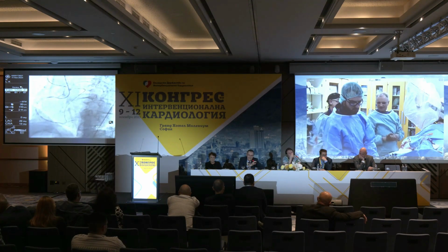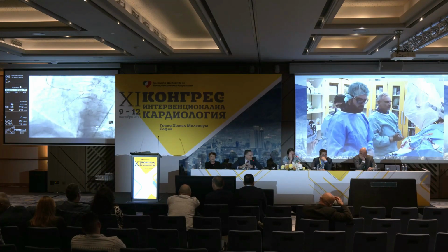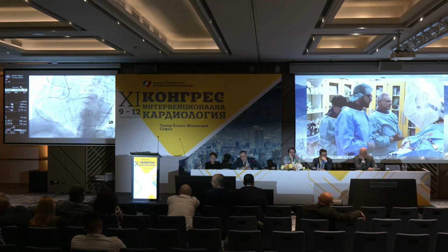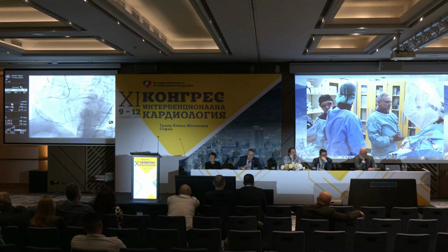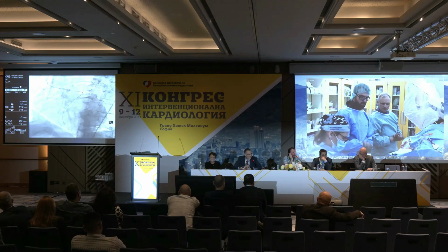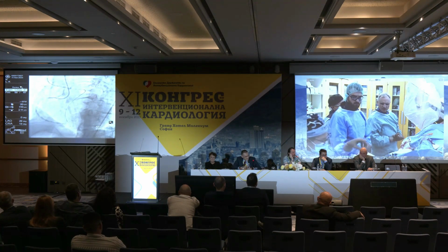If you open... Yes, of course. Okay, then IVUS. So, I don't know how much time we have left, but let's do an IVUS. You have 20 minutes. You are so fast. We have a lot of time.